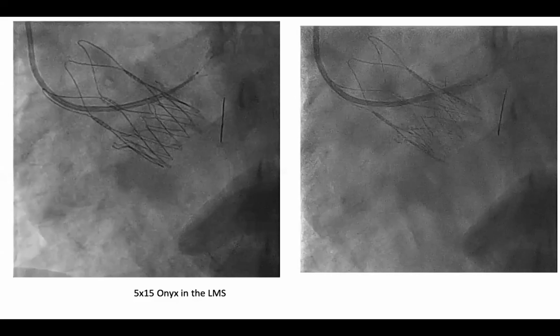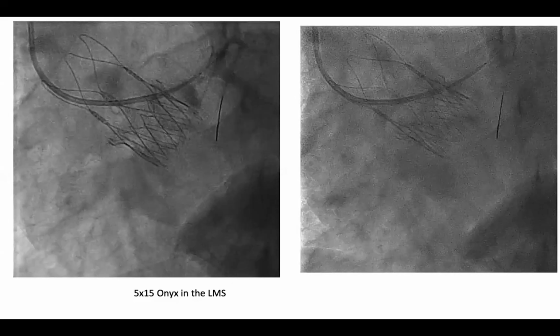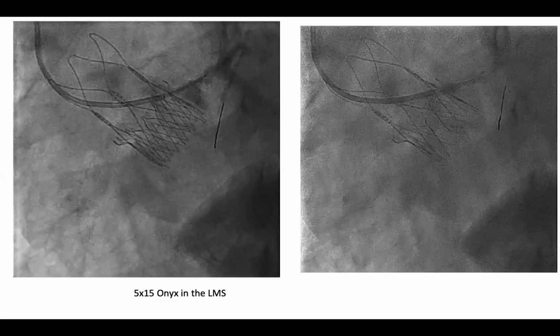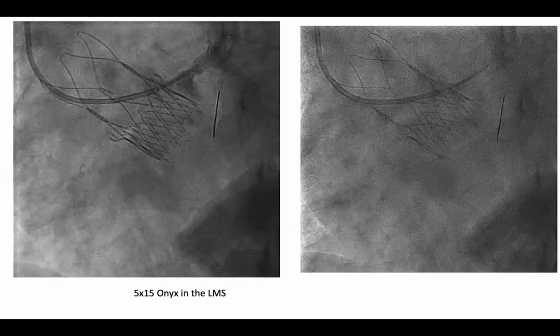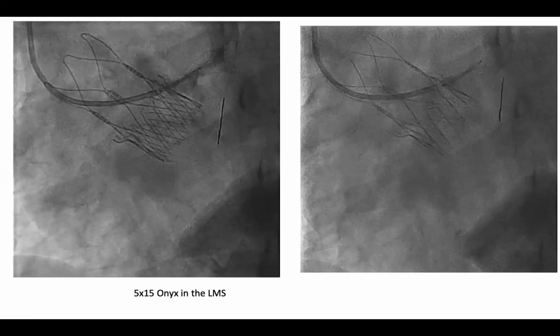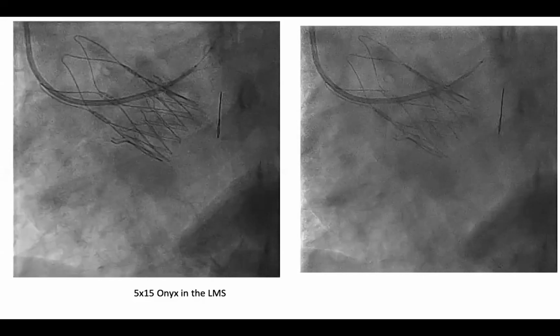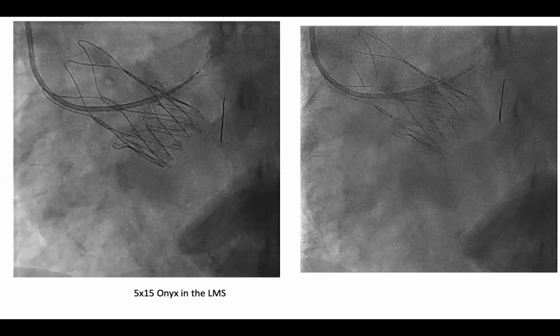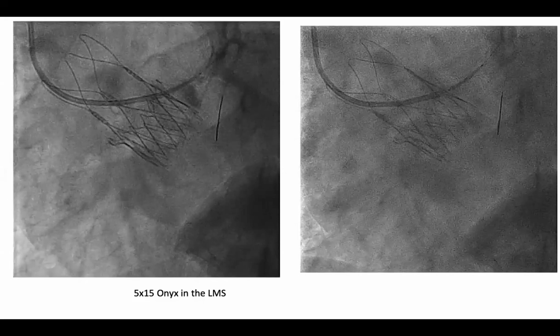Yes, I completely accept. I think the whole idea of this pre-dilatation here was not to make the artery as big as the ectatic left main, but to prepare the calcific segment enough so that the stent doesn't get crumpled or misshapen once it's deployed. So we just wanted to make some space for the stent.